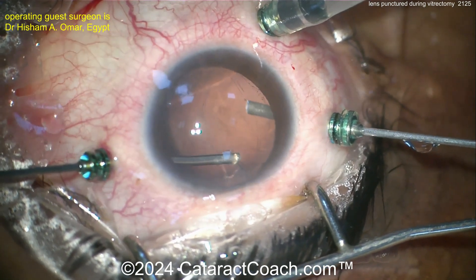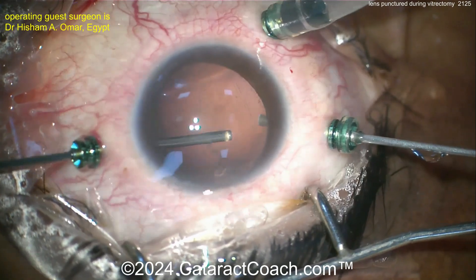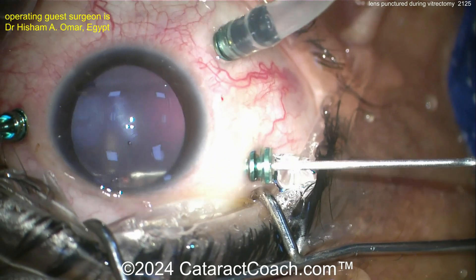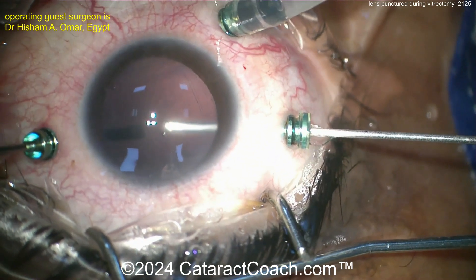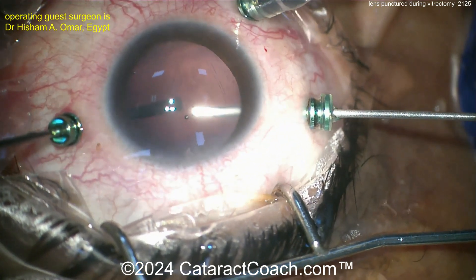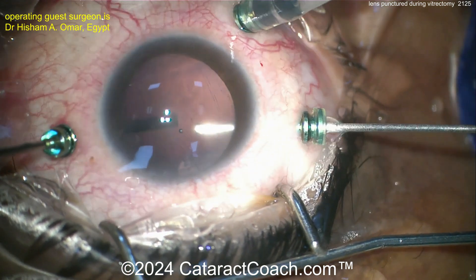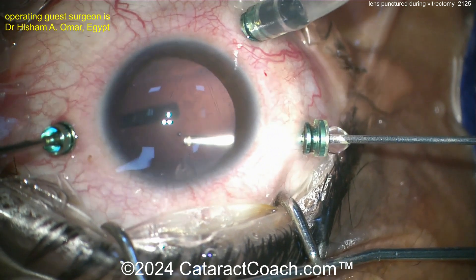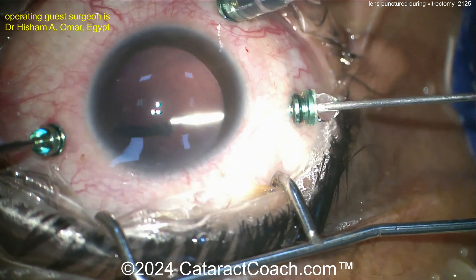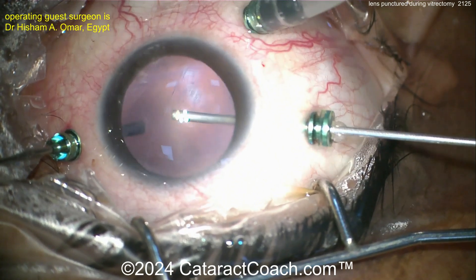The anterior capsule looks like it's still pretty much intact. Watching this video for the first time together — getting that last bit of lens material. The anterior capsule appears intact, so we can get an opening there: an anterior capsulotomy, then haptics in the sulcus.